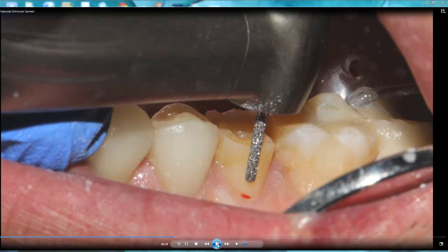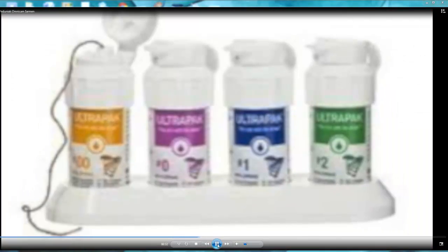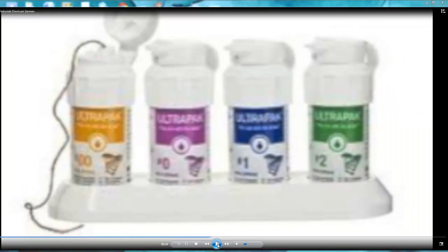I usually cut in 2 planes. You can see what I do in the buccal area. Then we use the same bur for the gingival third. I go around and remove the tooth structure according to the thickness of the bur, and I also use this to go to the final stage of my preparation, the polishing or adjustment of the prep.